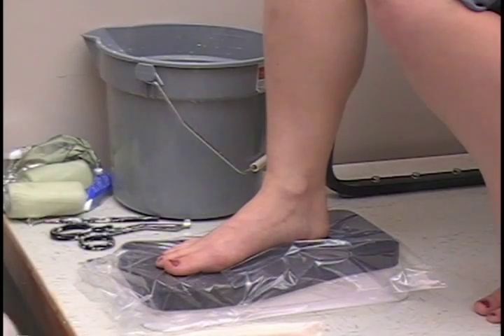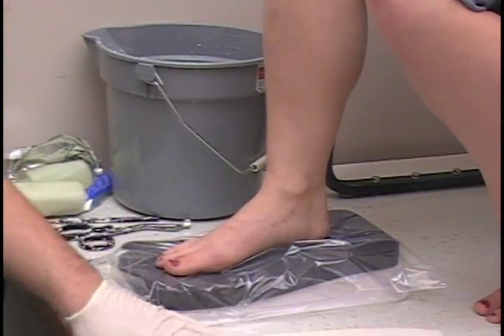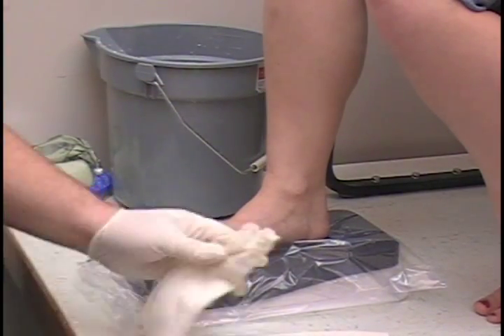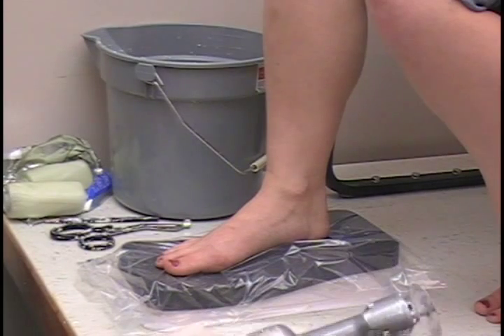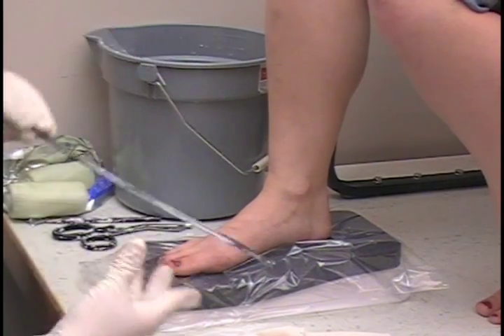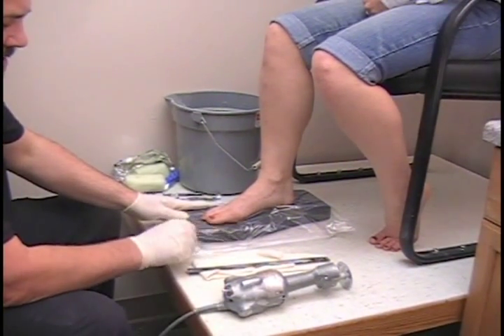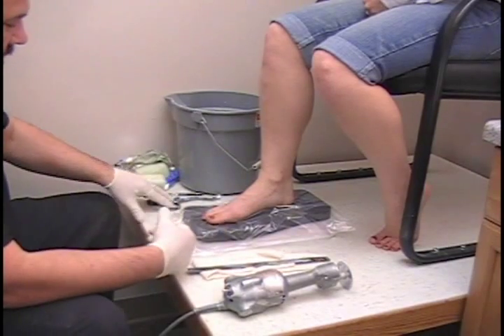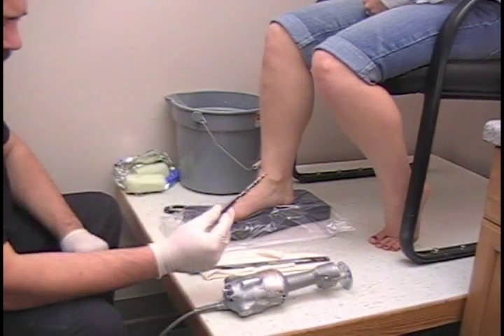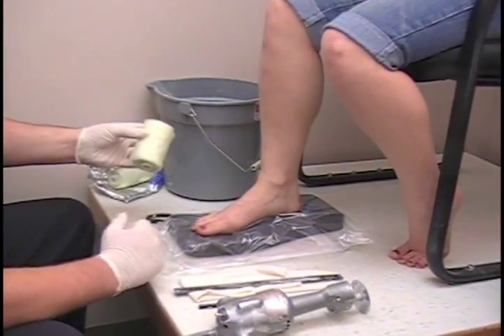In this segment, we'll be covering casting for custom-molded gauntlets. For this casting method, we're going to need a cotton stockinette about 12-14 inches long, a cast saw, a cutting strip, our casting block with plastic bag, and of course some gloves on your hand, and an indelible pencil.